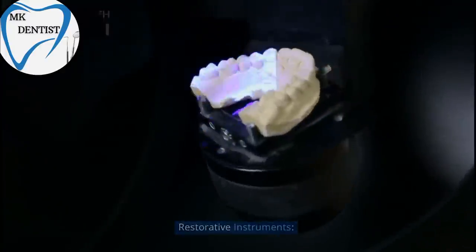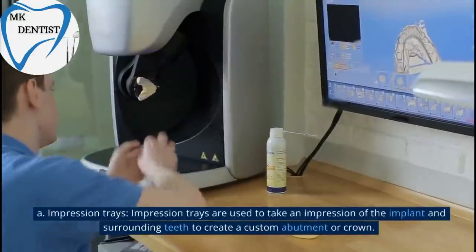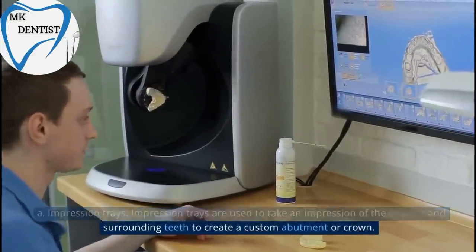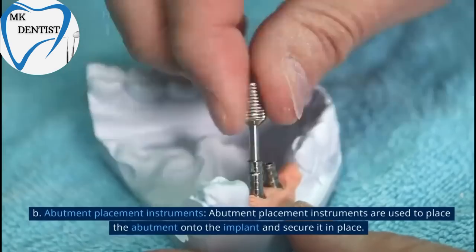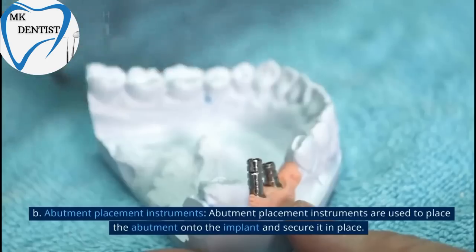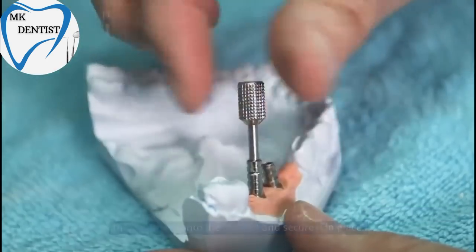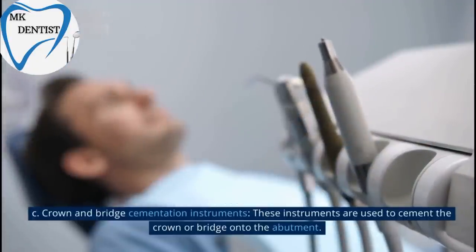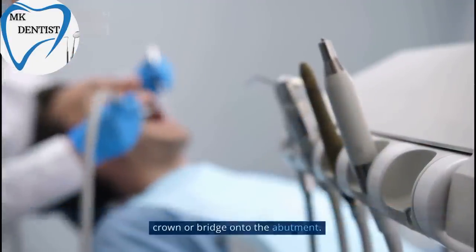Restorative Instruments. A. Impression Trays. Impression Trays are used to take an impression of the implant and surrounding teeth to create a custom abutment or crown. B. Abutment Placement Instruments. Abutment Placement Instruments are used to place the abutment onto the implant and secure it in place. C. Crown and Bridge Cementation Instruments. These instruments are used to cement the crown or bridge onto the abutment.